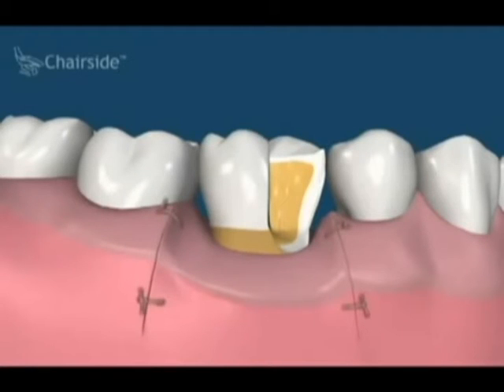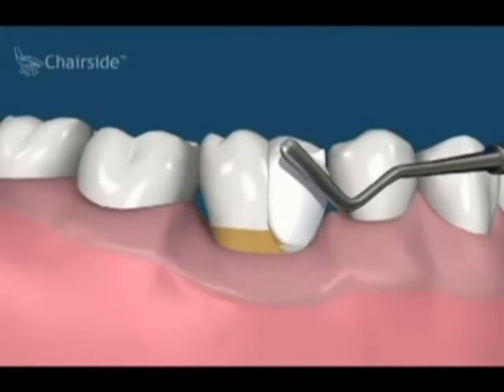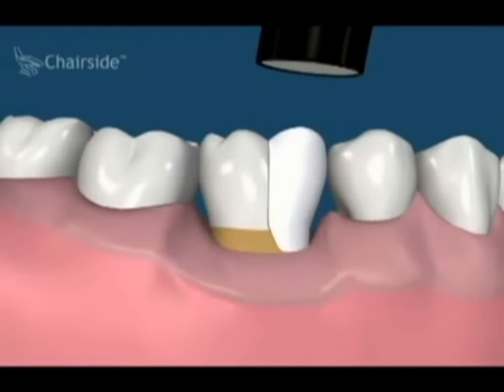The flap is repositioned and sutured into place. After healing, the tooth can now be restored. In this situation, a light-cured resin filling is used first to replace the lost cusp.